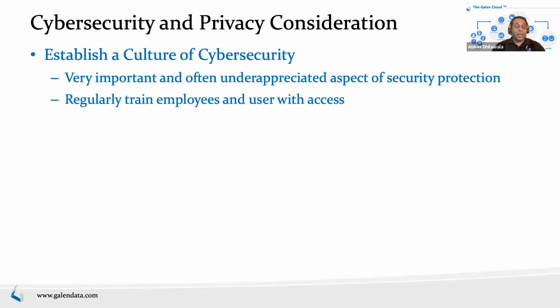Training is important. You want to regularly train your employees because these things change, and even if things haven't changed, having that feedback loop constantly going helps people remember and be on their toes when things come up. And find and define your access control.